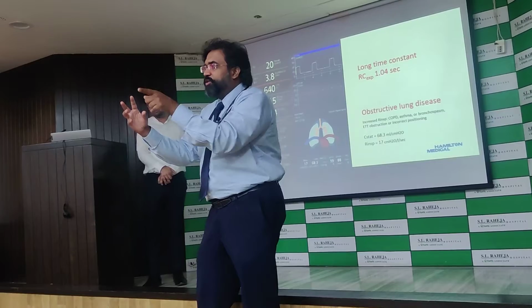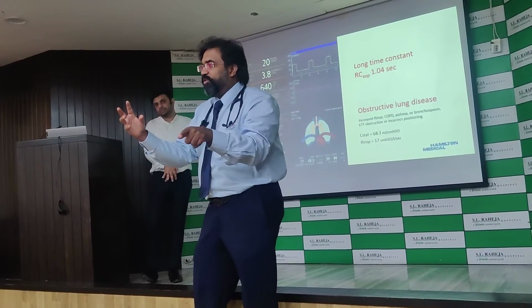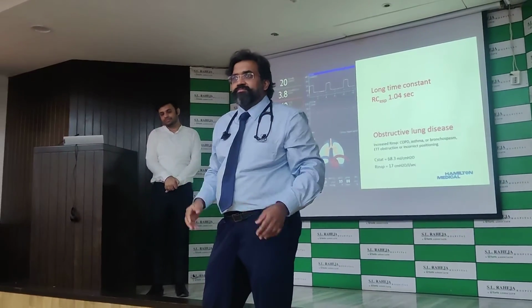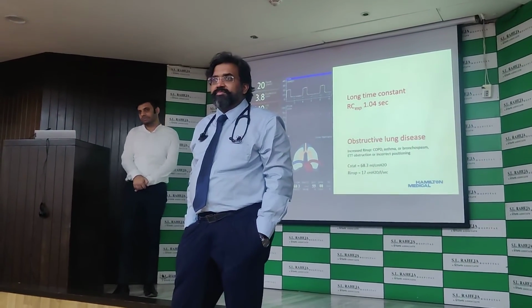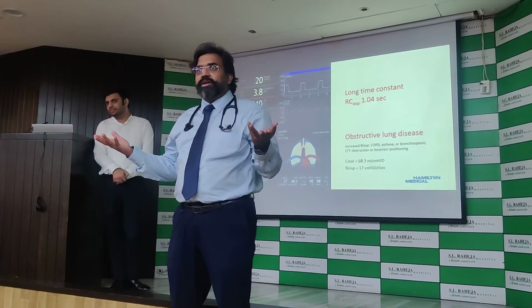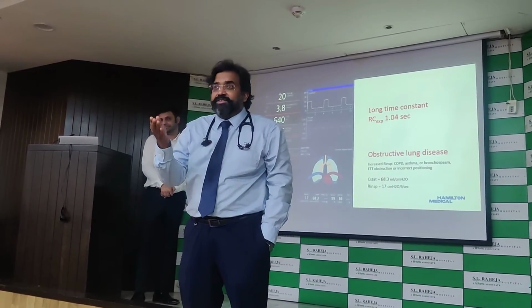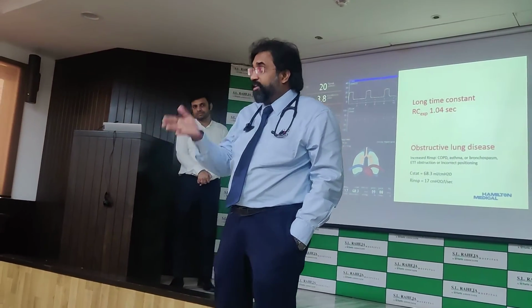These may be deflating even slower, so it is still having a flow. So your plateau pressure may not be the right pressure. So instead of holding for 2 seconds, 5 seconds. We don't know. It can be 5, it can be 2, it can be 1, it can be so on, an average only. That is why it is an average. That is why the plateau pressure is an average.